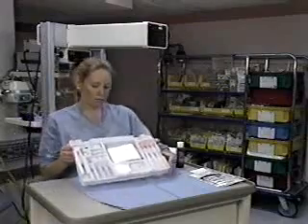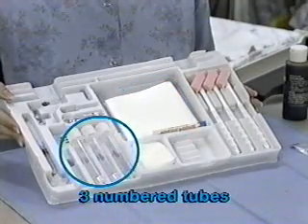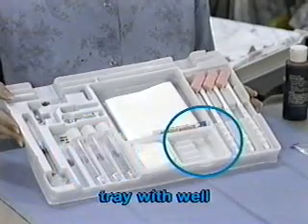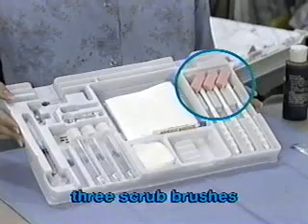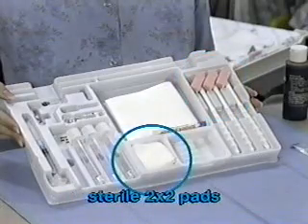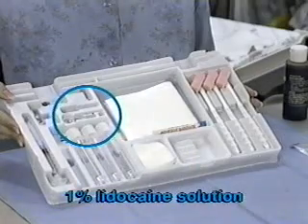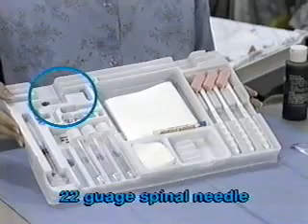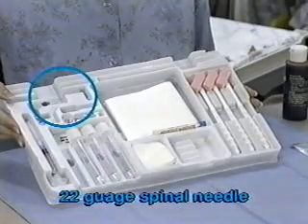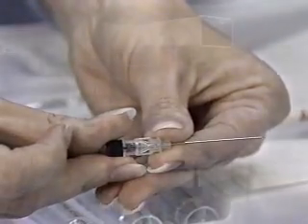These kits generally include sterile drapes, 3 numbered tubes for collecting CSF, a tray with a well for betadine, 3 scrub brushes for prepping the puncture site, sterile 2x2 pads, 1% lidocaine solution for injection as a local anesthetic agent if used, and a 22-gauge spinal needle, preferably with a clear hub, which allows for immediate visualization of CSF flow.